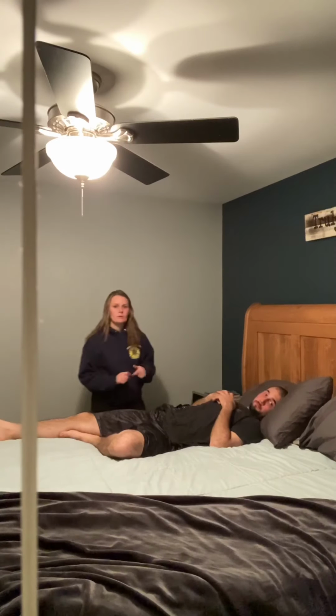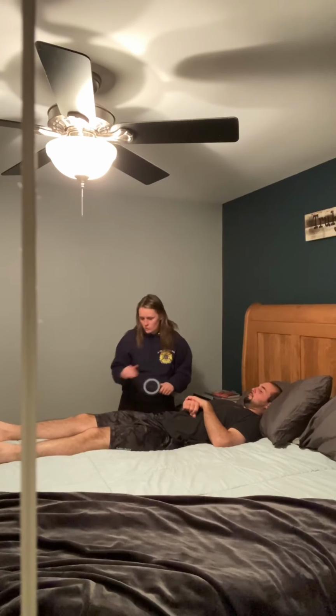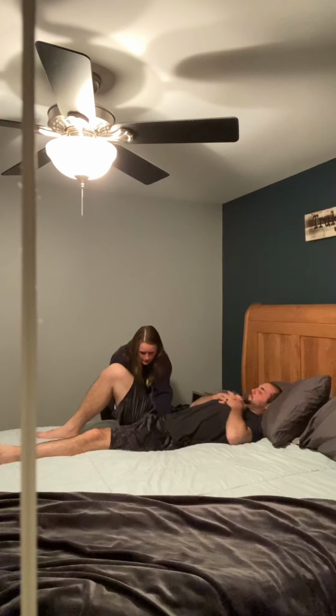So this video will be for goniometry of hip flexion and hip extension. We will do hip flexion first. You'll have your patient in supine. You're going to bend your knee up. Our fulcrum is going to be at the greater trochanter, so I'm going to put that there.